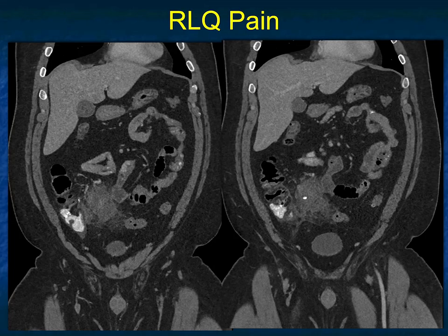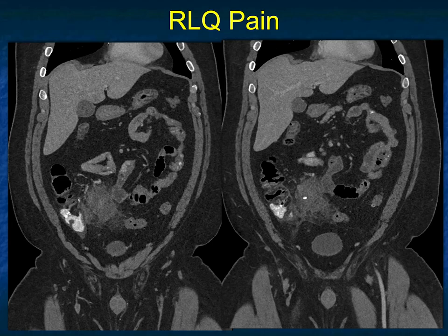What about this case? Large mass, right lower quadrant, and there's a calcification. What could this be? Perforated Meckel's — rare. Perforated cecal cancer. Perforated carcinoma of the terminal ileum. This also, almost exactly like the last case, was a perforated appendix with an abscess.